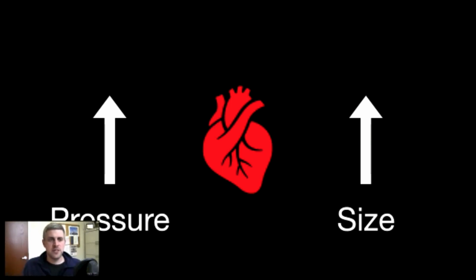That increase in pressure is going to result in an increase in size. So that RV responds immediately by dilating, because it can't just immediately hypertrophy and respond to that increased pressure. It's going to have to just accommodate that by getting bigger, right? And that's kind of the big picture effects of what's going on inside the right heart. And from there, we're going to see some echo effects and some of the things that we're going to talk about today come into play.